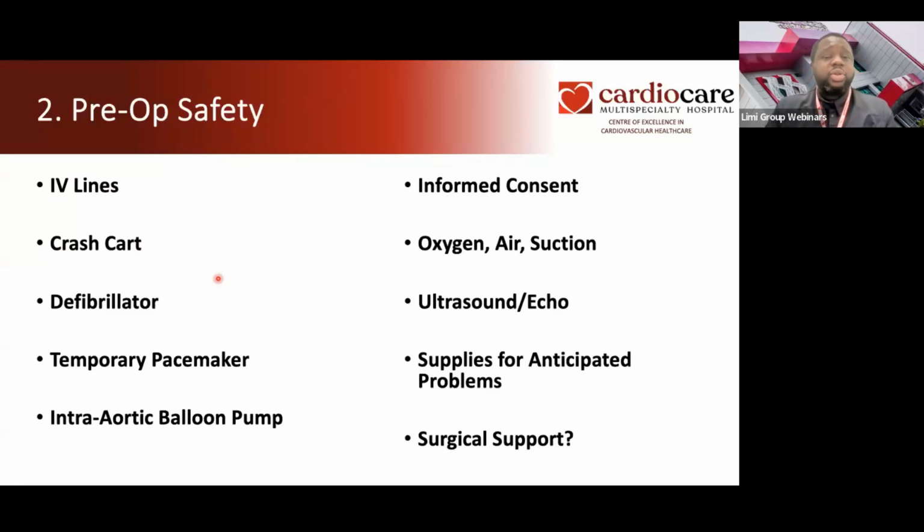So Prof was asking in the comments, about a patient who had died on a cath lab table somewhere, and was wondering sometimes what are the things. So a cath lab must have all of these things ready and on hand as much as possible, because sometimes when you give the dye, patients can react. Patients can have a VFib. Patients can be very sick as you're trying, they could have that. And if you cannot defibrillate immediately, you will lose that patient.